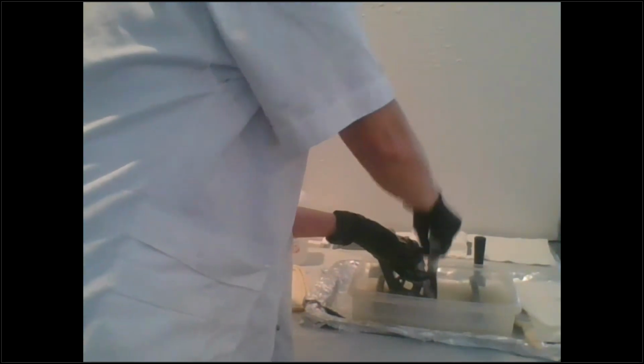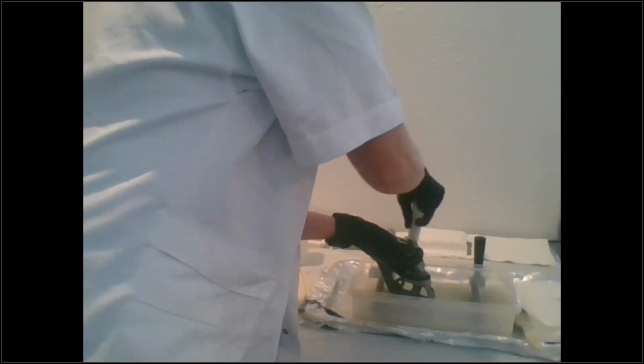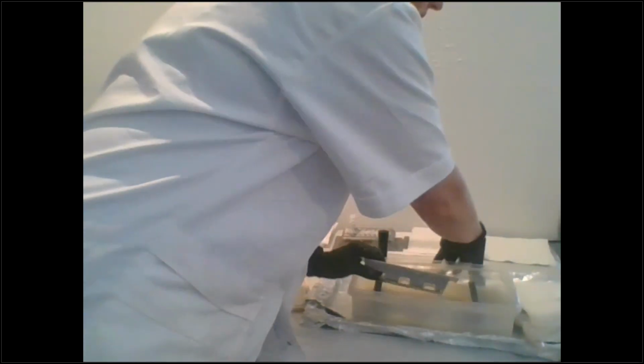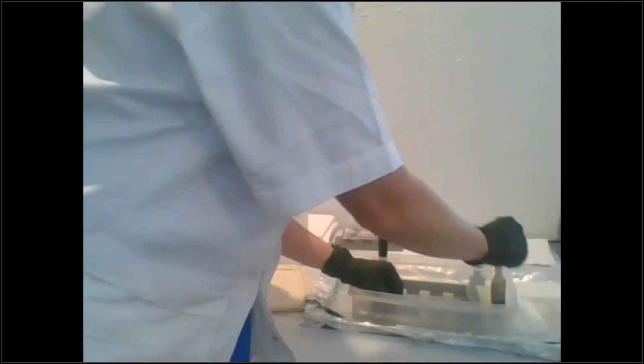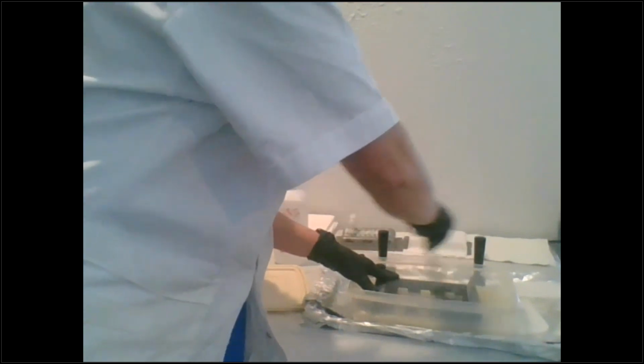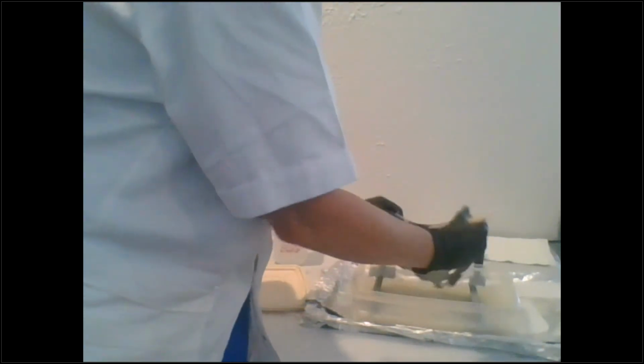So there might be a couple of things that are waiting or that you didn't get punched, depending on how thorough you were with it. And you also have a paintbrush that came. So that's why I like to have it in this little bath. I just brush off my part or my build platform.